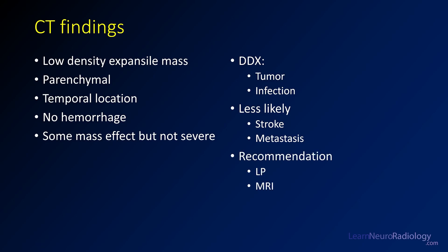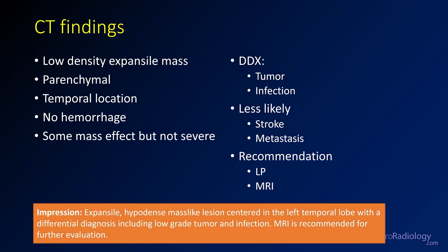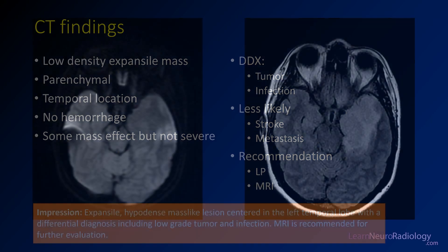This person is going to need an MRI. They may or may not need an LP if there's concern for infection. When you're making your impression on this case, you want to describe this as an expansile, hypo-dense mass in the left temporal lobe, with a differential including low-grade tumor and infection. MRI is recommended. That gives them everything they need to know in the emergent setting.